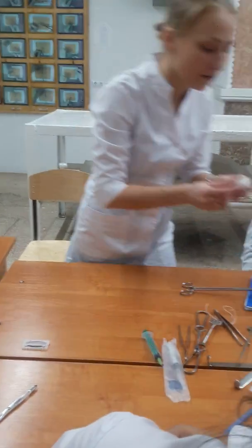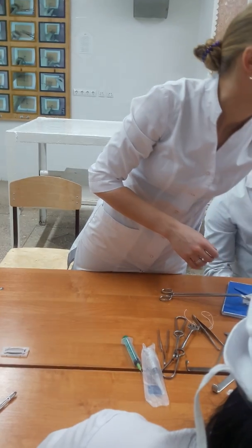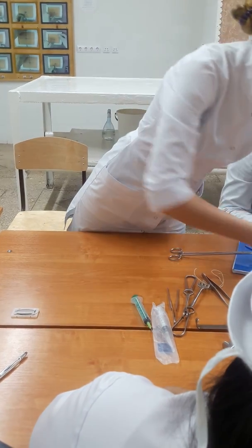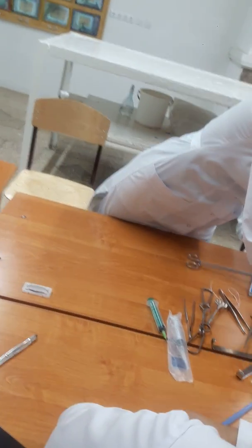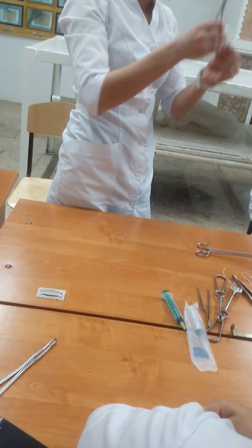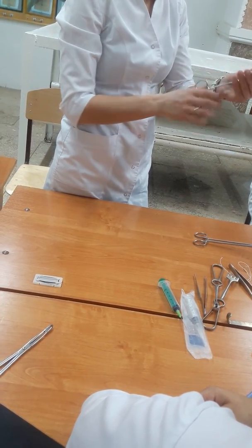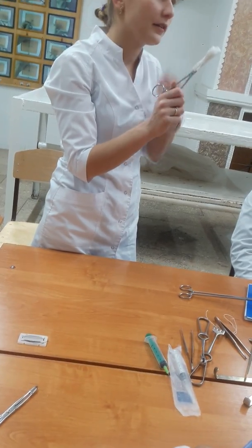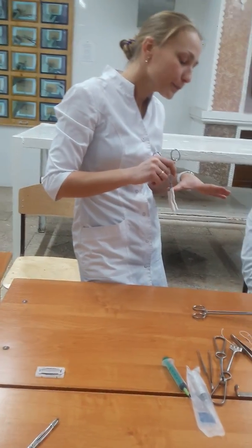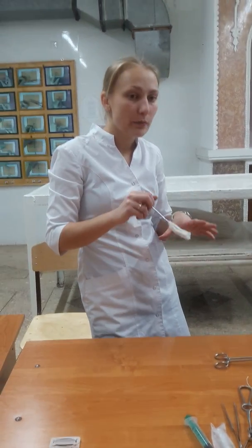We have another kind. Give me the clamps, please. No, all of them. This construction we use to remove the blood inside the wound, and to make a revision.